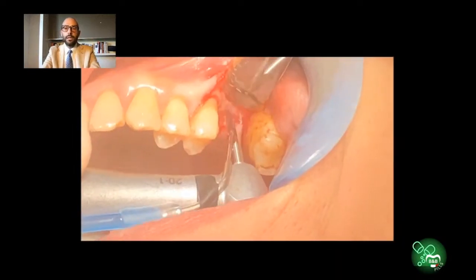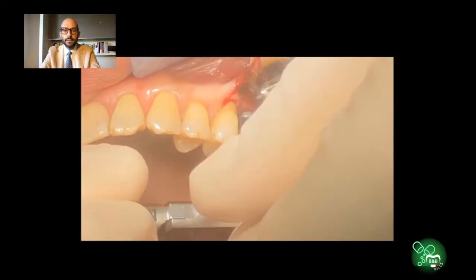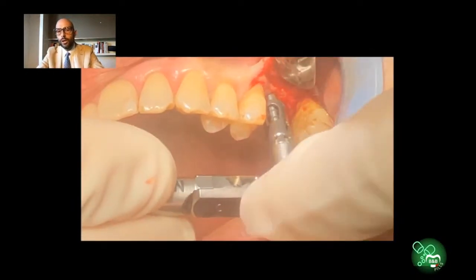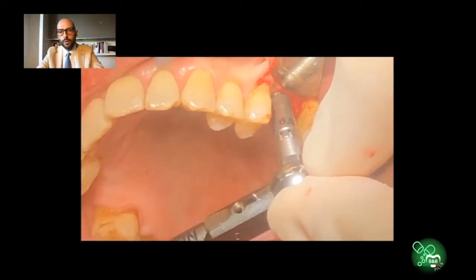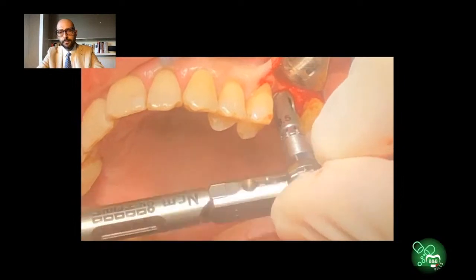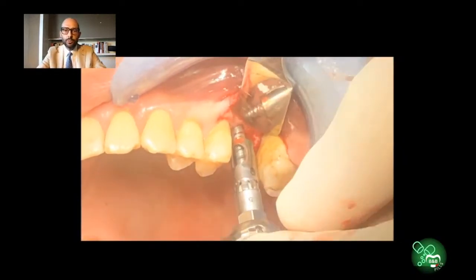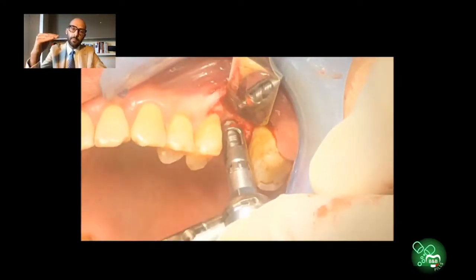And then we can go through our unique drill, that is a pilot drill. In this case, we use a 6.5 mm stop device, and progressively we go from the 2 mm diameter to the 4 mm diameter expander, from yellow to green, just to allow progressively the elevation of the Schneiderian membrane.